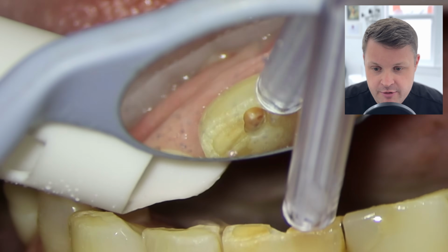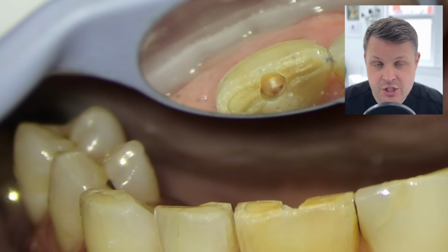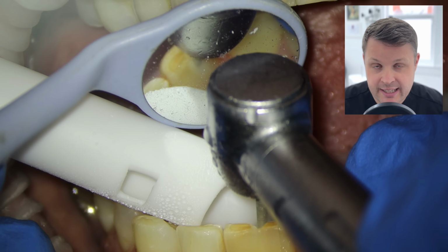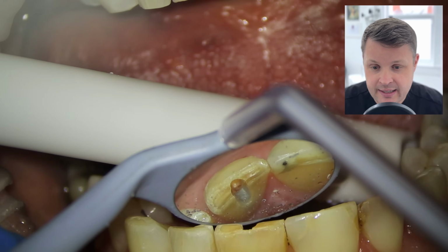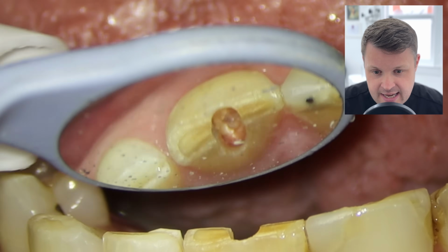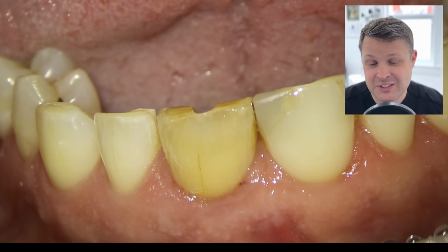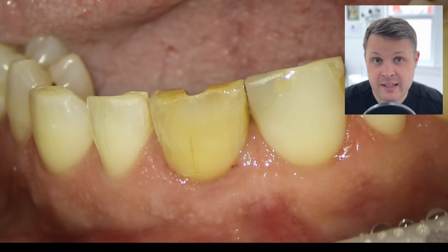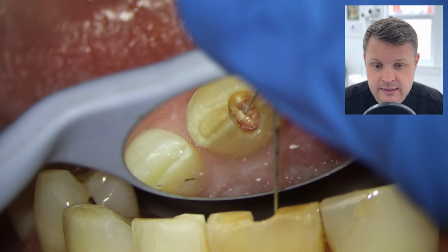But I'm just checking the orientation. I'm using the high energy ultrasonic here to see if I am going to breach any obvious orifice, but I don't. I'm just going to do a little bit more drilling, checking my orientation. I'm thinking maybe I need to be a bit more palatal, making a little bit of an assessment here. And now I'm thinking, have I removed too much palatally? So there's always a bit of a weigh-up, isn't there? And obviously you can see here that I've made a bit of damage to the incisal edge, but I make sure I'm straight down the middle.